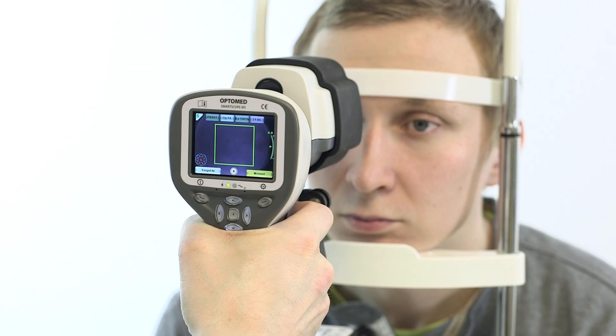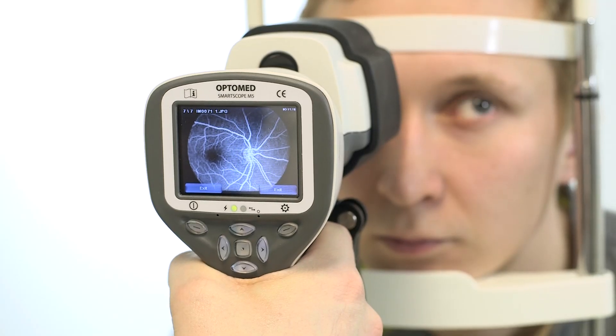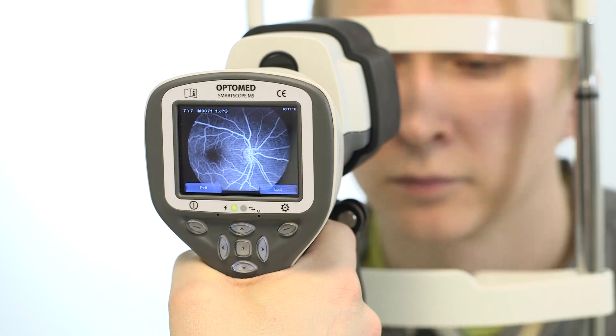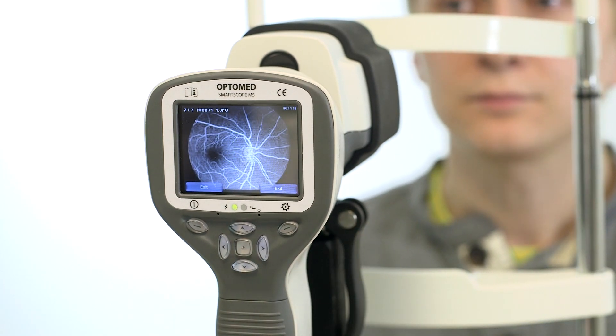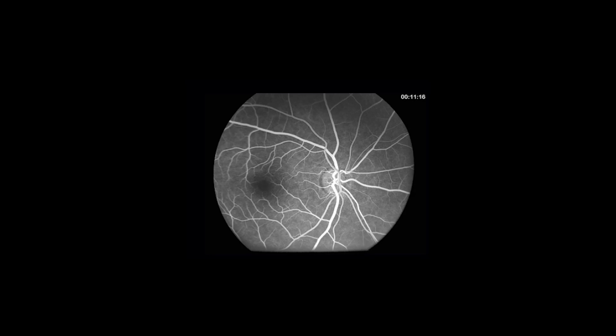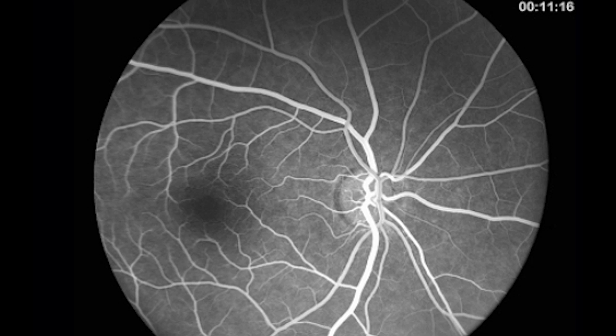If the square is green, then the aim is good and the image can be taken. The taken image is displayed on the screen until the user clears the image by pressing the shutter, left, or right soft key. The image can be zoomed in the instant preview by pressing the middle key. Instant review can be turned off in the FA menu according to user need.